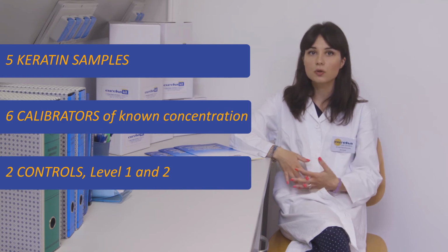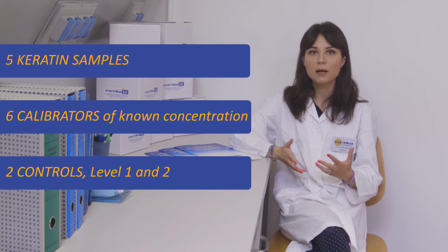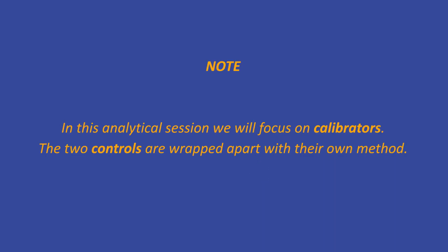The first phase is the preparation of unknown samples. For convenience, in this analytical session, we will focus on the calibrators. The 2 controls are prepared apart with their own method.